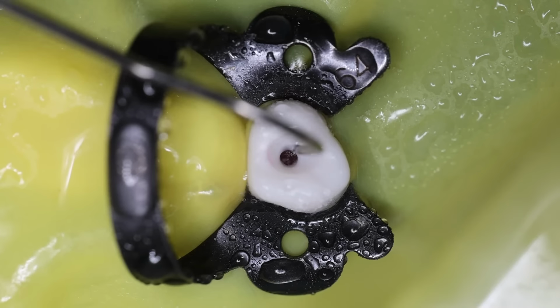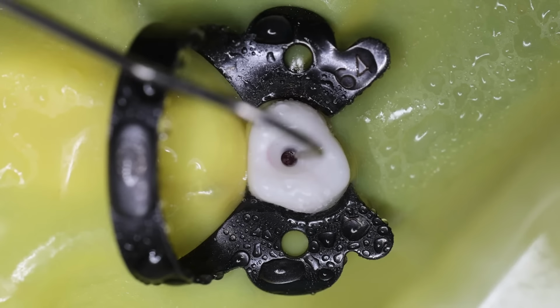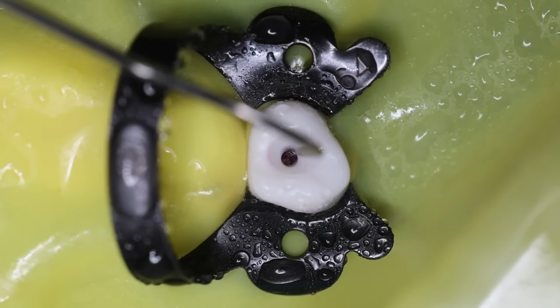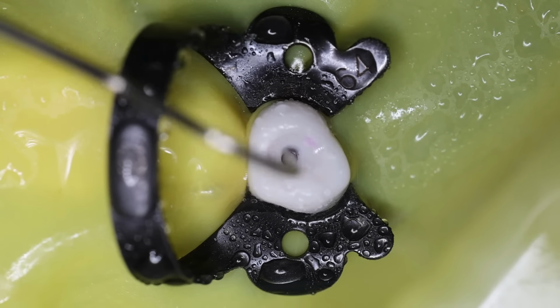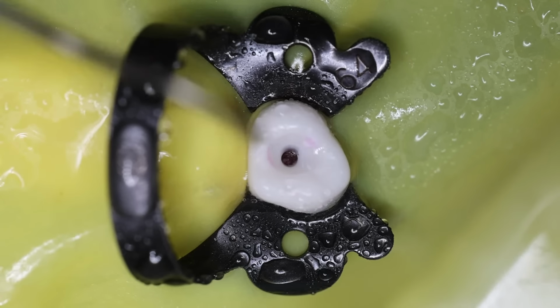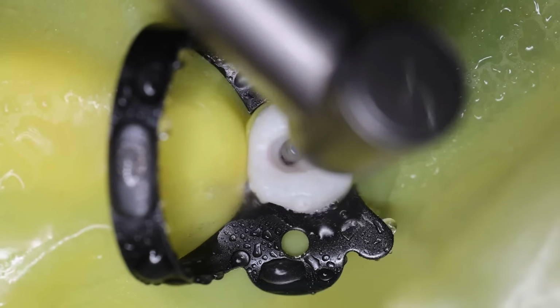While removing the caries, if we suddenly expose the pulp, then there is an option of direct pulp capping, but we don't prefer that in a primary tooth because of lower success rate. In a permanent tooth, if this happens while removing caries, then we need to proceed with direct pulp capping. Okay, so here we have exposed the pulp. Now we will remove the roof of this pulp chamber again with this round burr, slowly, not going deep.